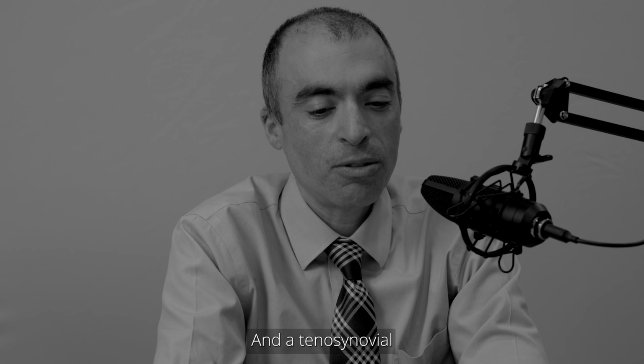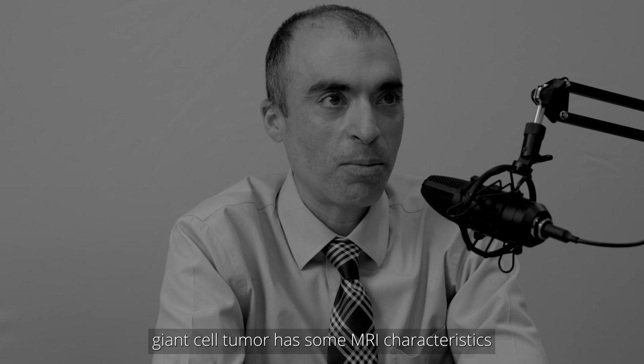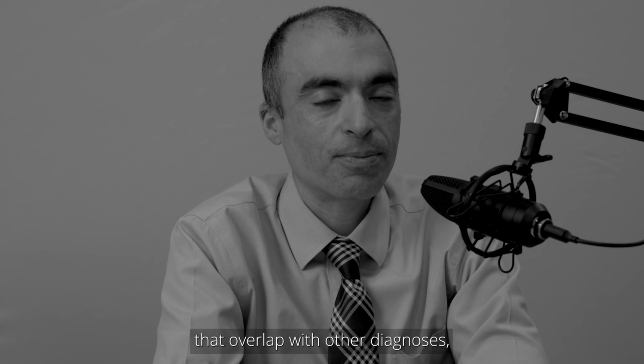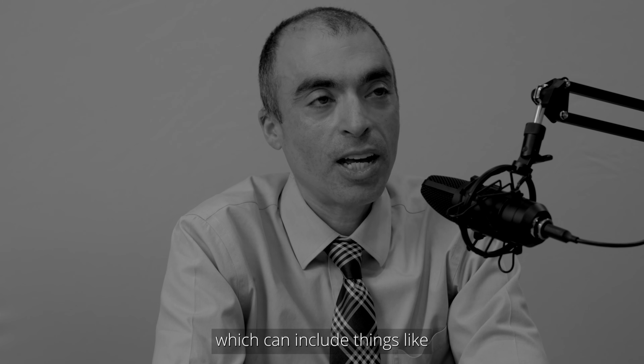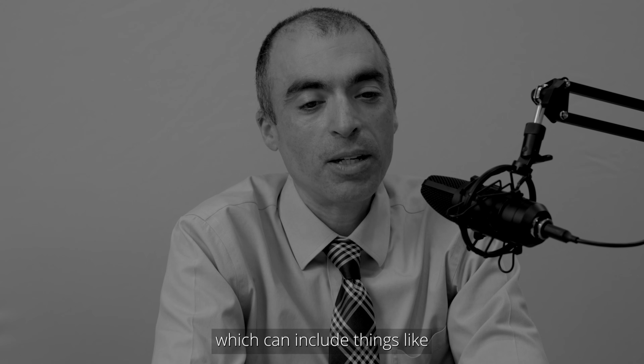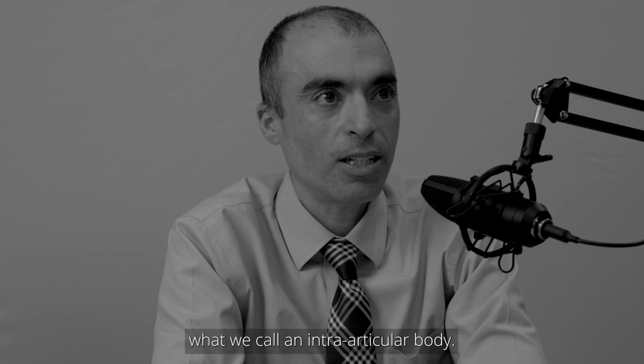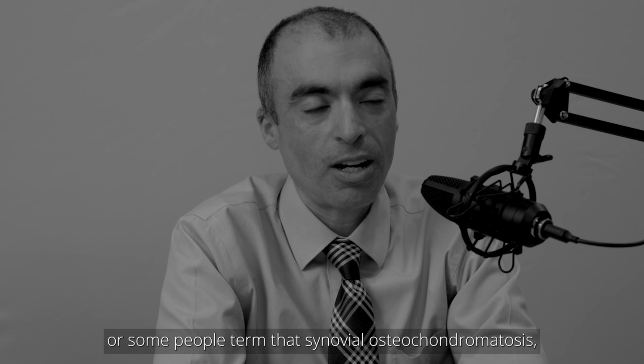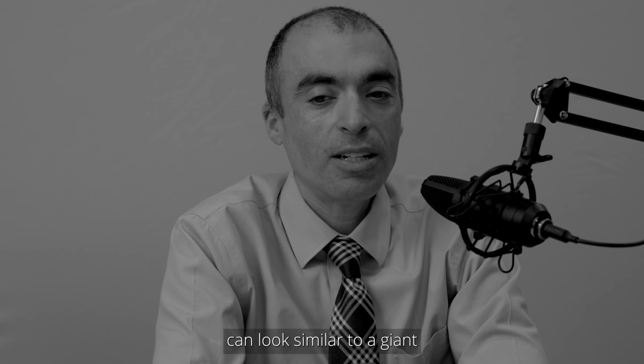And a tenosynovial giant cell tumor has some MRI characteristics that overlap with other diagnoses, which can include what we call an intra-articular body, or some people term that synovial osteochondromatosis, which can look similar to a tenosynovial giant cell tumor.